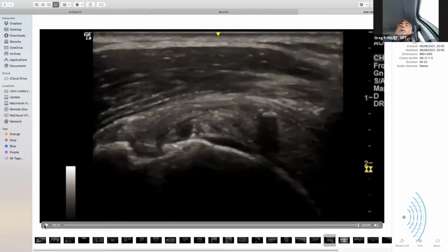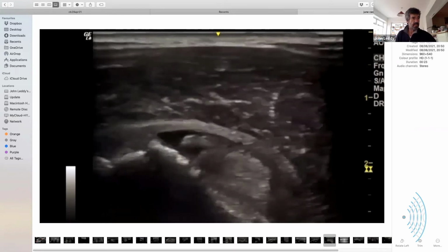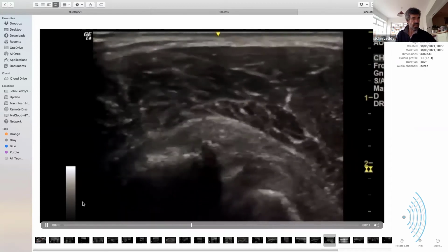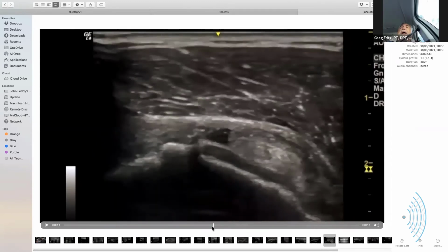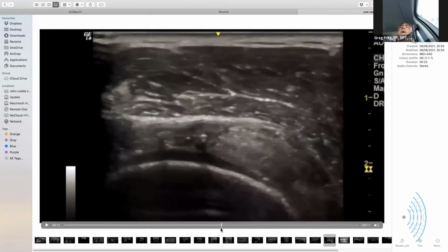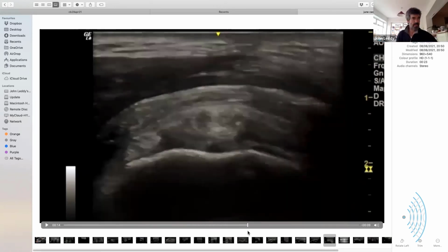This one. What is this, really quick? And then I'm going to need to run. Yep, that's all right. This is a re-rupture of a supraspinatus. So there's a little bit left there, and you can just see the stitching. Oh yeah, I can see in your short axis those little sutures coming toward me. Yeah, there. It hasn't all ruptured, but there's a lot of it that's gone.